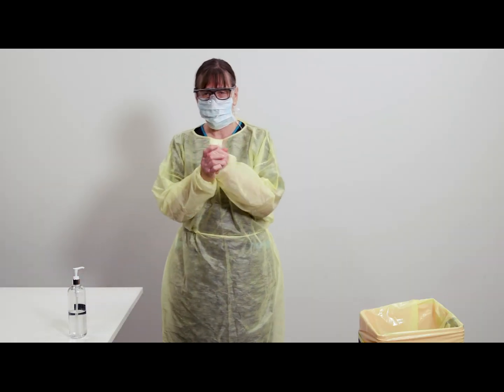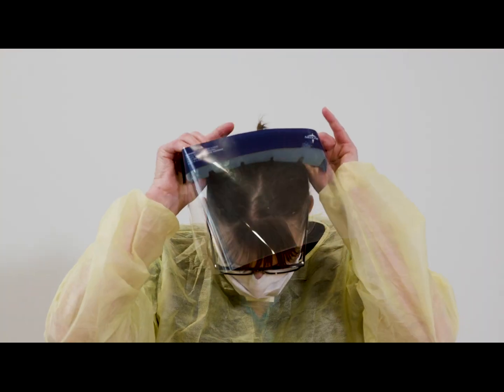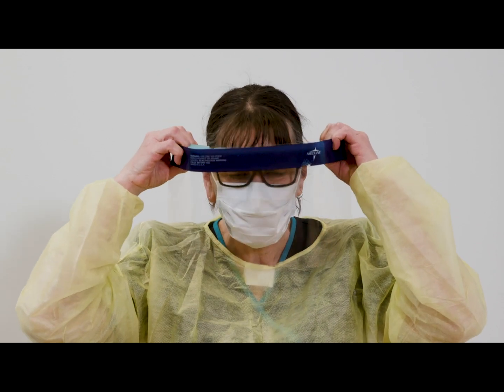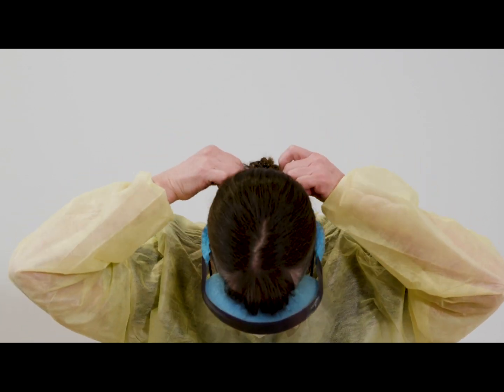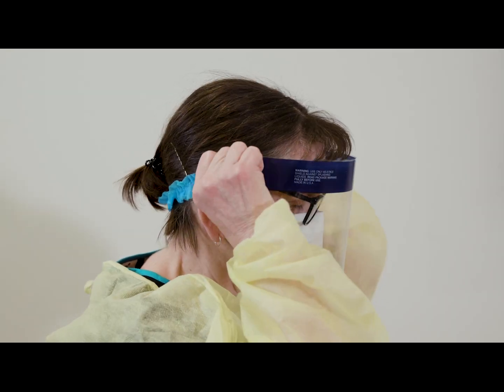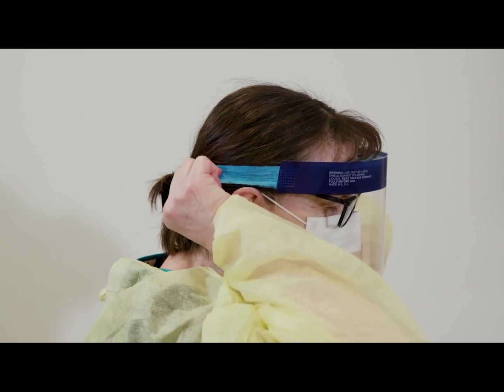Before putting on your face shield, perform thorough hand hygiene. To put on a single-use face shield, bend forward slightly. Hold onto the elastics with both hands. Expand the elastic with your thumbs and place the elastic behind your head. Do not touch the front of the face shield.